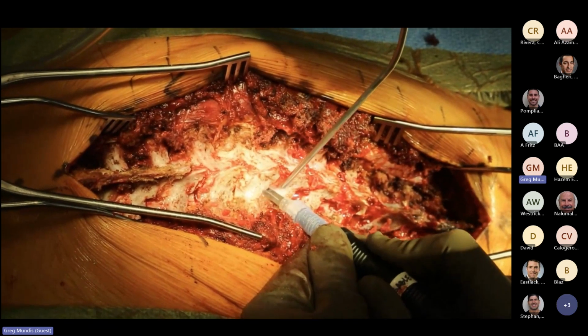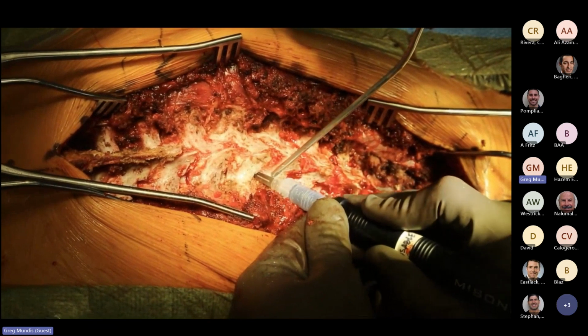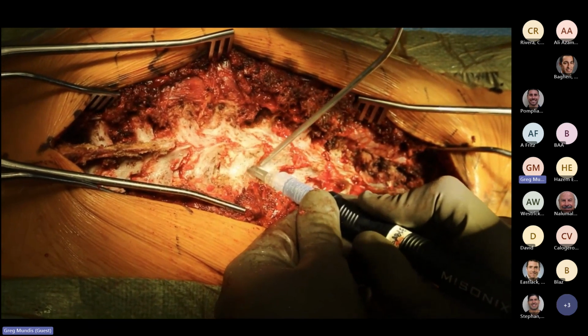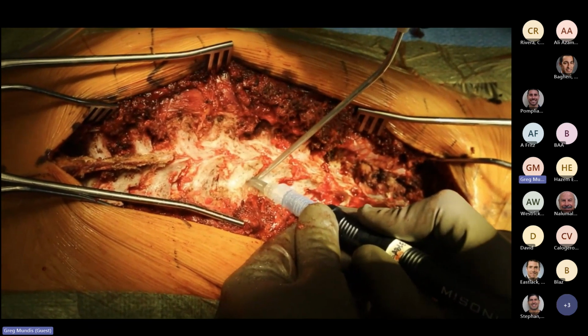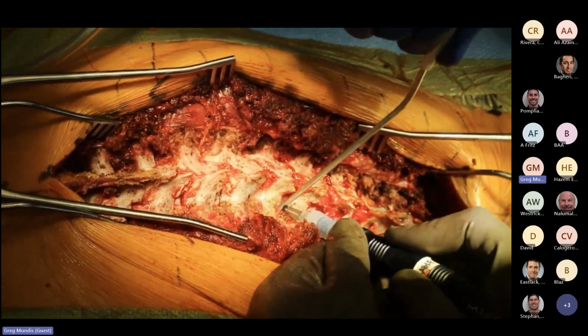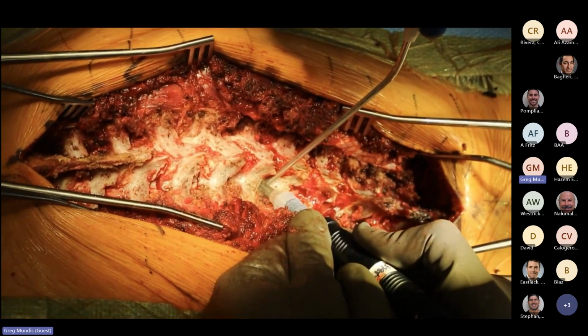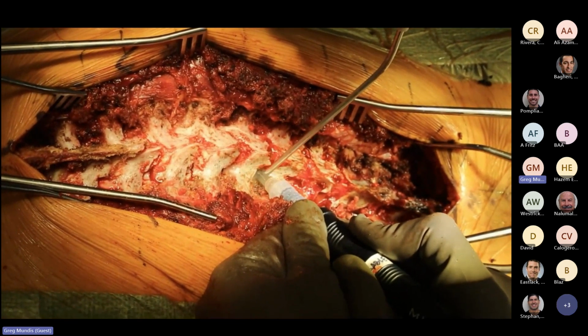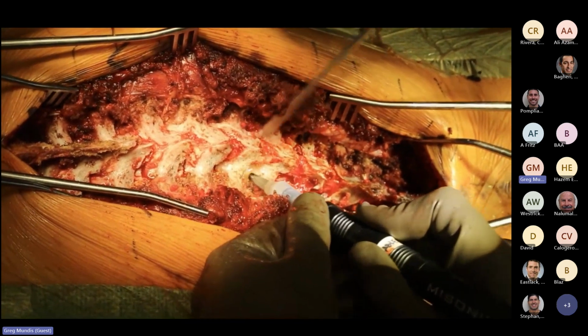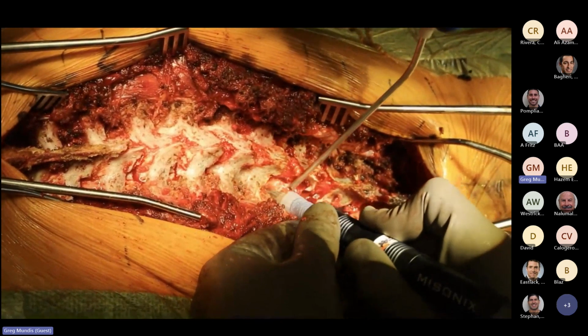Now, depending on the flexibility of the patient, you might need to do this bilaterally, or you might need to do this bilaterally in combination with taking down the ligamentum flavum at every level. And you can see here the ligamentum flavum is actually still preserved in this environment. So this cut is simply going from a point, I would say about halfway up the IAP, and just cutting it across, and you're releasing this tether in the back.